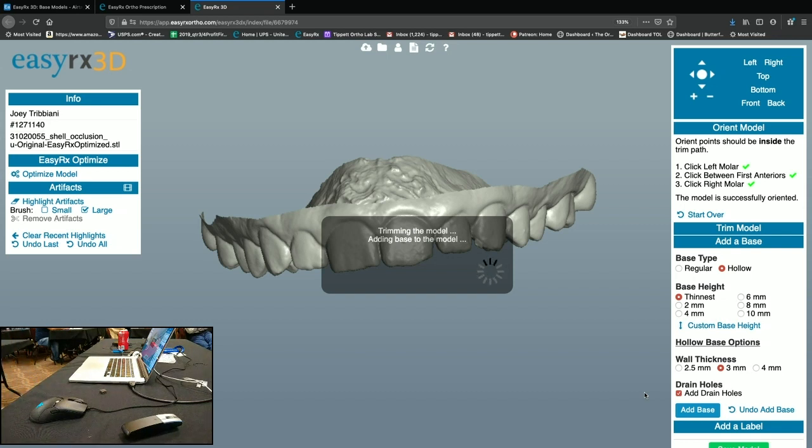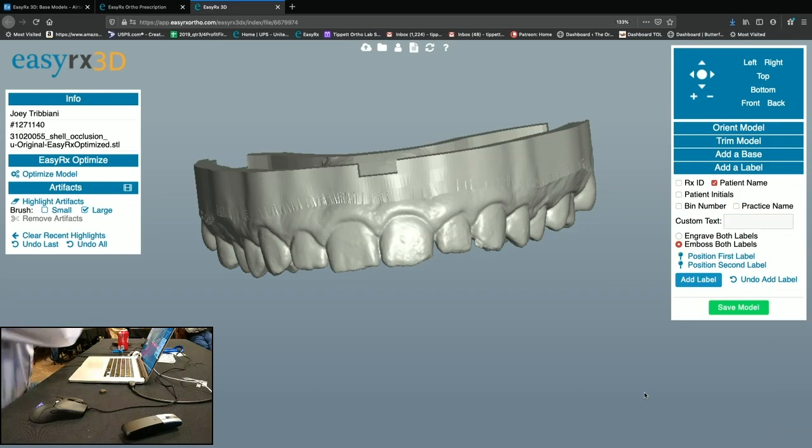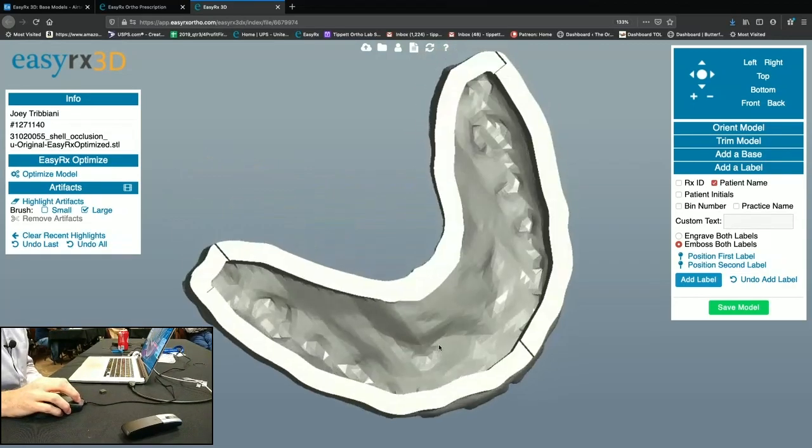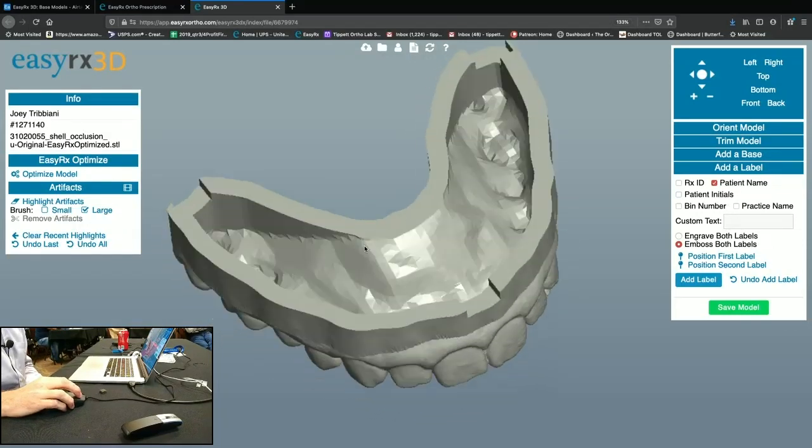Yeah, it's all dependent on your dots. So I've noticed that if there's a big curve of Spee, it'll throw your occlusal plane off. So you sometimes have to move your dots around to try to get a nice flat plane. Oh, there it is. So then this is perfectly flat to fit on your build plate on your printer. And then there's the inside, and there's your drain holes.